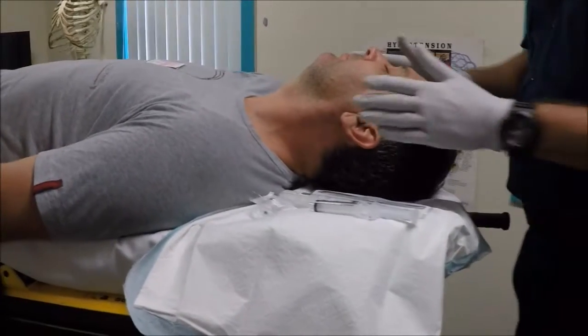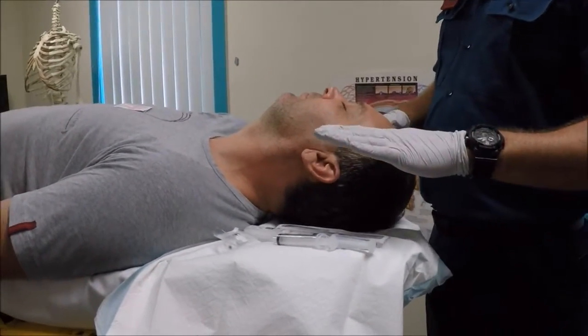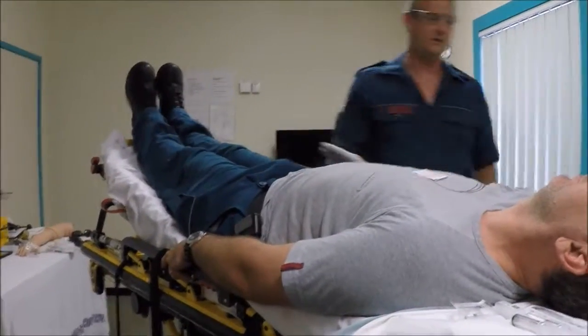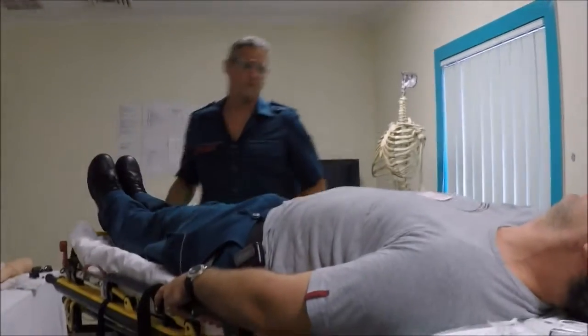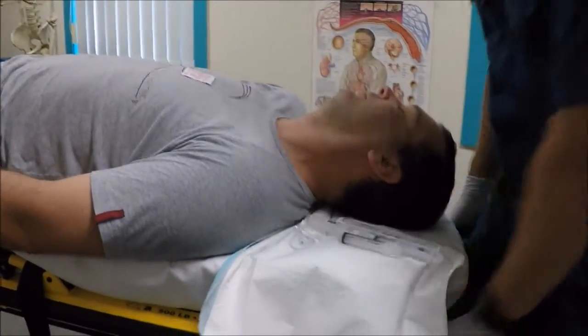Alternatively, in a situation where, say, the patient's on the stretcher in the back of the ambulance or they're on the ground and we can't actually drop their head 15 degrees, what we can do is put the patient into what we refer to as the modified Trendelenburg position, where we lift the patient's legs to facilitate some postural drainage. In this case, because Brian's on a stretcher and we can put him in the proper Trendelenburg position, I'm going to drop the head of the stretcher a touch, just to facilitate some venous filling.